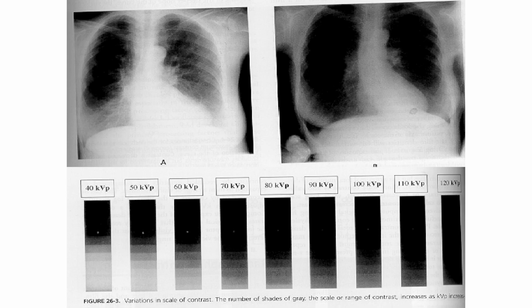Okay? So, kung gagamitan natin to ng high contrast ang chest, di ba? Tingnan nyo naman ang difference. Kung may pathology, hindi natin makikita yung pathology. Di ba? Let's say, kung nakikita sa letter A, okay, let us assume that yung haziness or opacity sa lower left lung, ay let's say pneumonia.